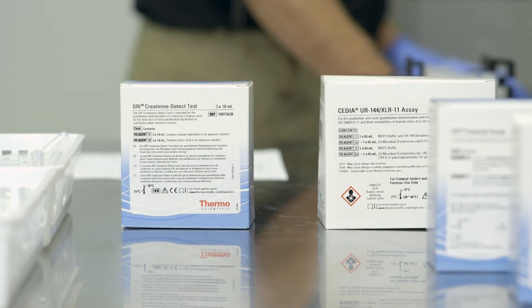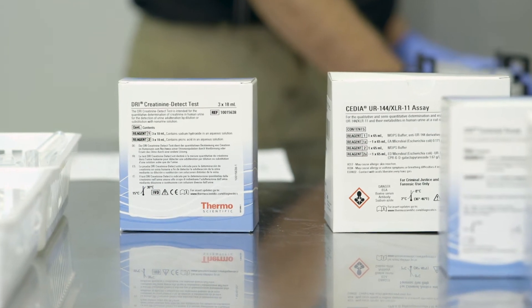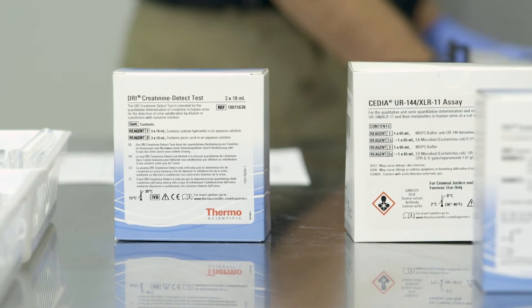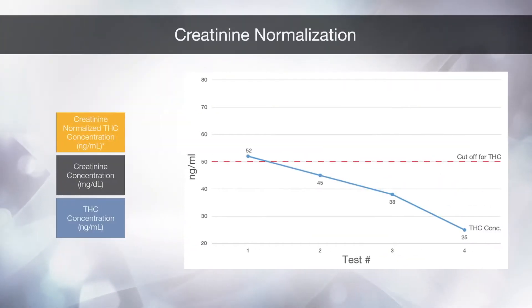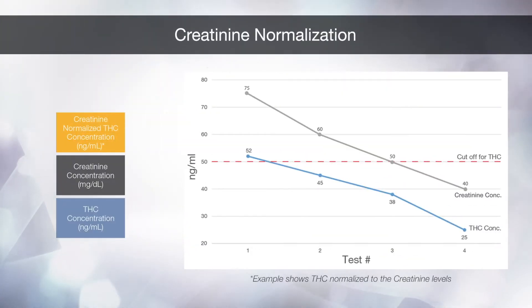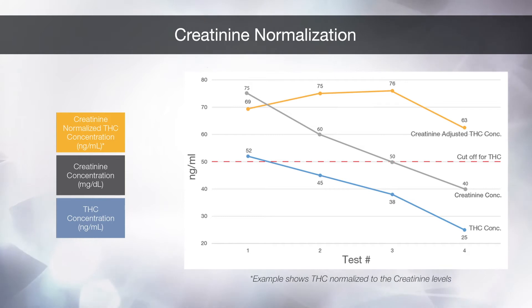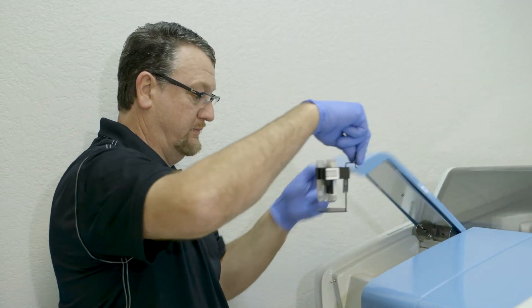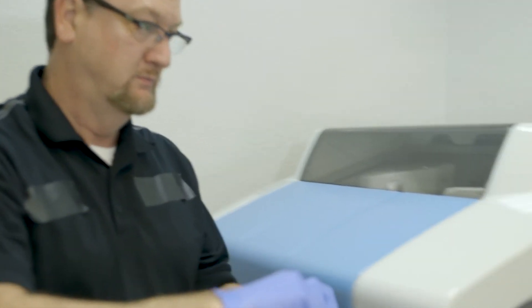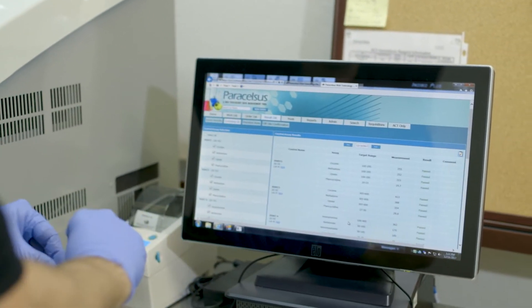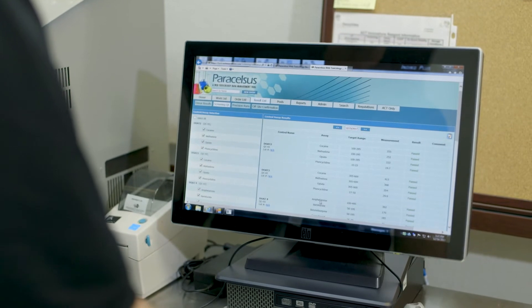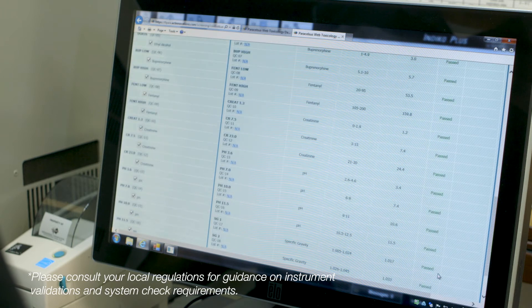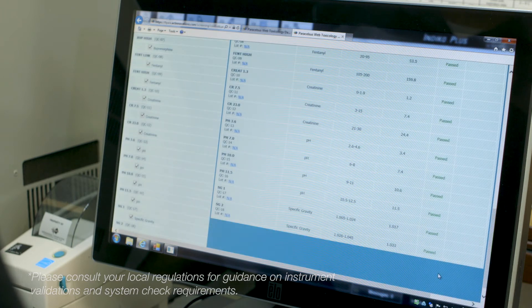A common test to detect dilution or substitution is to test for creatinine, a naturally occurring product that appears in urine at a constant rate. For example, if creatinine levels are lower than normal, it could be an indication of tampered urine. To ensure testing results are accurate, weekly and daily system checks are performed using calibrators and controls.